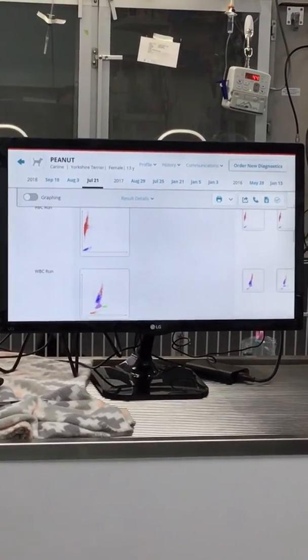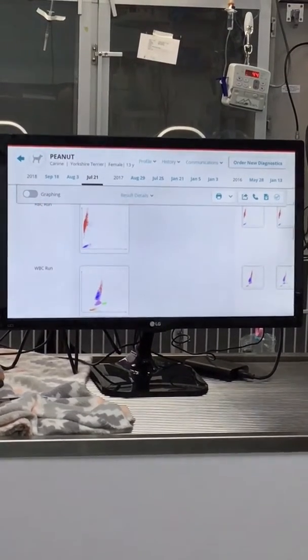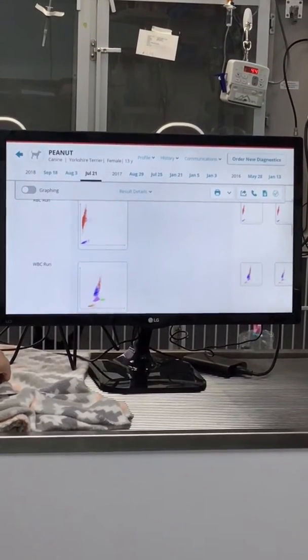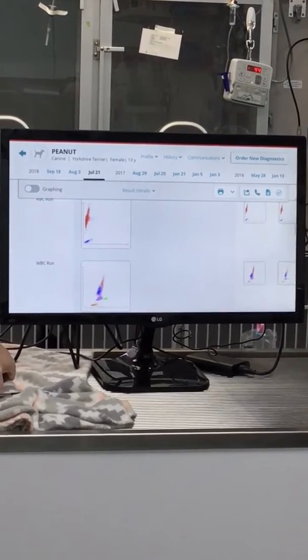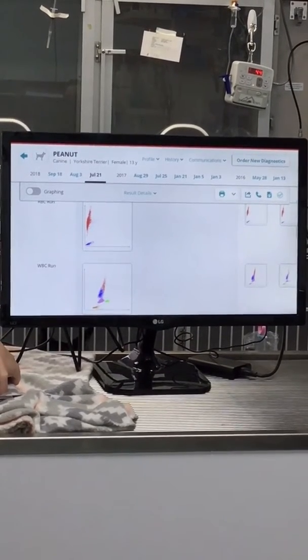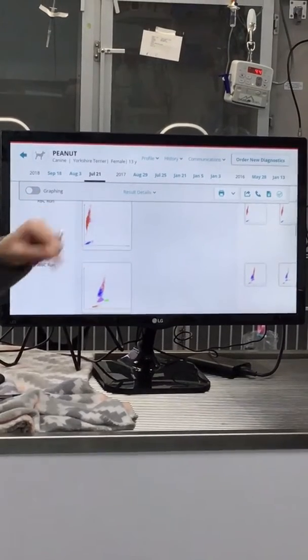Y'all ever look at the little graphs on the bottom? I was at a hospital last week, and they had a dog come in with just a little bit of ADR. They did a chest x-ray, it looked like blasto, sent it out, and it wasn't blasto. But I looked at the dot plot and thought, that looks like a lymphoid leukemia. I didn't even look at the numbers, I just looked at the graph, and I would be concerned about that.